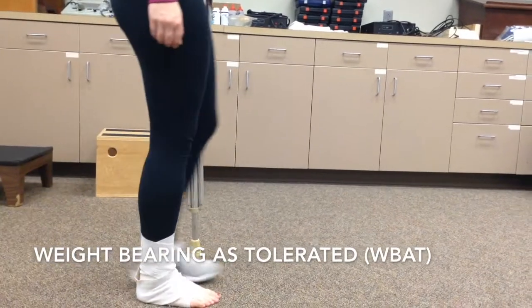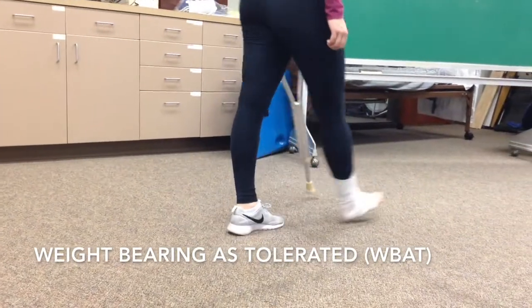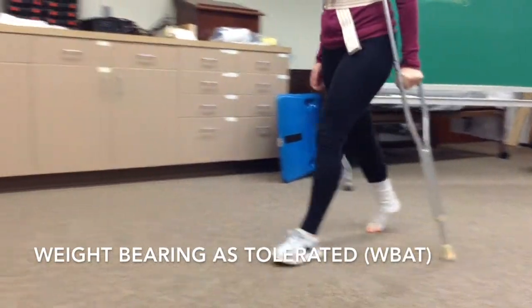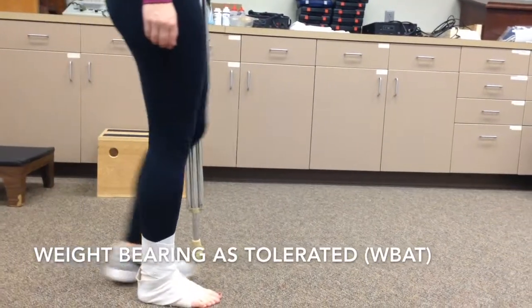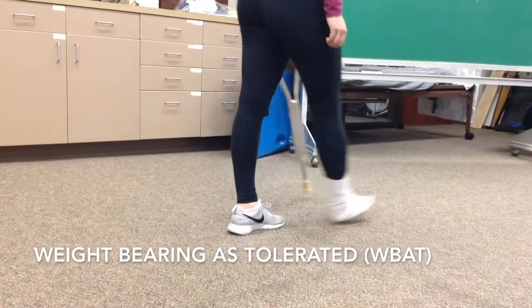Weight bearing as tolerated occurs when the patient has limited restrictions. The patient will determine how much weight will occur on the involved lower extremity. This can vary from minimal to full depending on the patient's tolerance. The assistive device is used just to take slight weight off of the involved extremity.